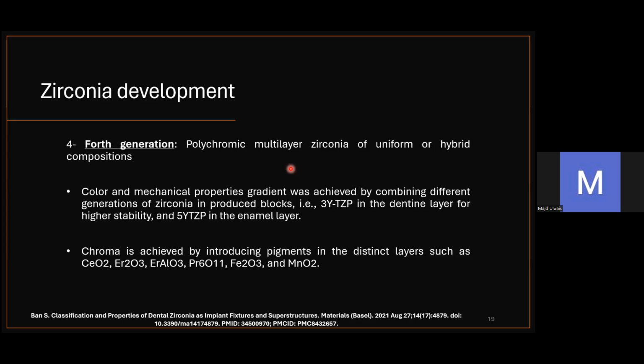So to mimic this feature, polychromatic multi-layer zirconia of uniform or hybrid composition was created. In this generation, they combined different generations, the previous 3 generations.